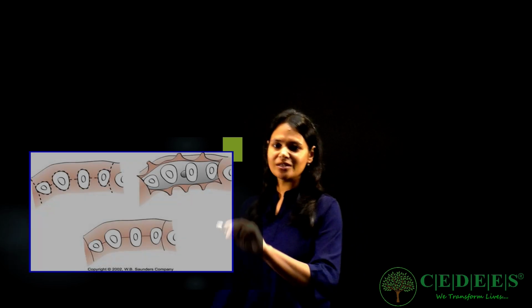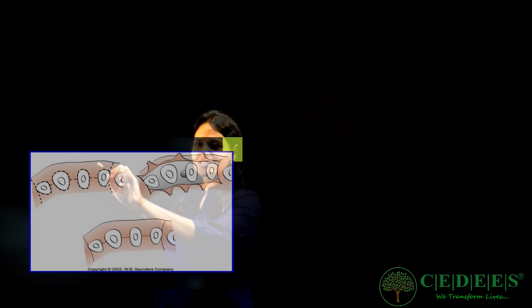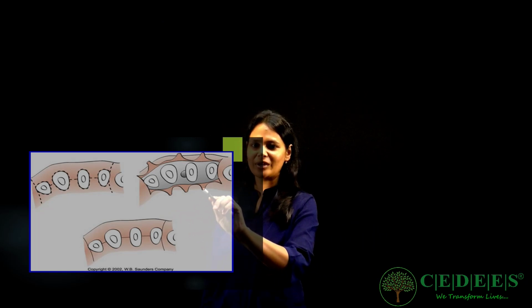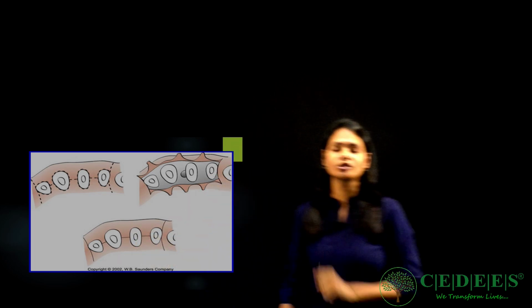So which flap is this? Is it a papilla preservation or a conventional flap? As you can see here, right in the middle, this is the buccal flap, this is the palatal flap or the lingual flap, and right in the middle they have cut the papilla. So of course this is a conventional flap. That's how you get half the papilla here and the second half of the papilla here, and then you put it back. So this is a conventional flap.